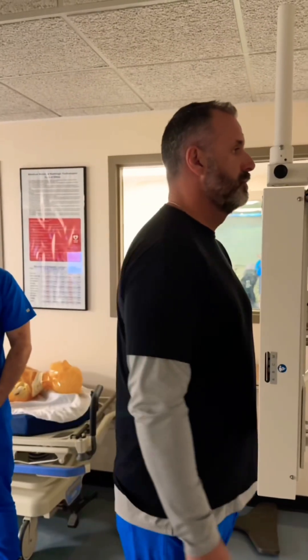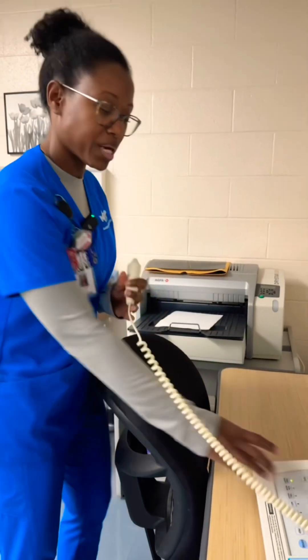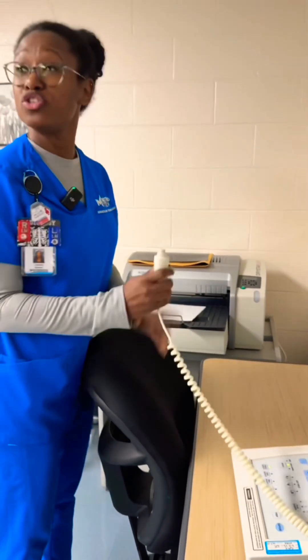All right, I would set the patient up for a PA chest, so I'd have him turn and face the board, roll your shoulders forward, hands on hips. Okay Patrick, hold your breath.